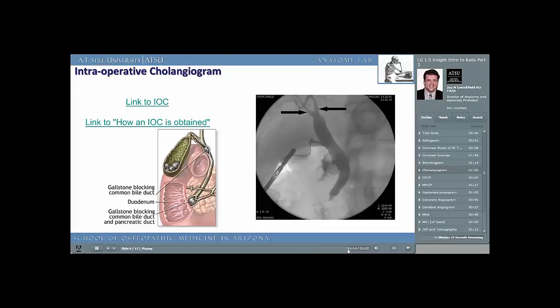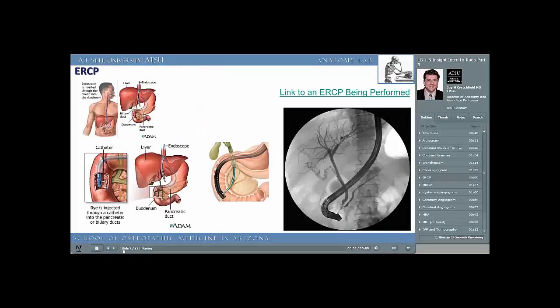The video is taken from one of my actual patients. It's taken during removal of a gallbladder, a procedure called a cholecystectomy. Our technology has become so good, a procedure which is now commonplace allows the physician to insert an endoscope through the patient's mouth, past the esophagus, into the stomach, and finally into the first portion of the duodenum.